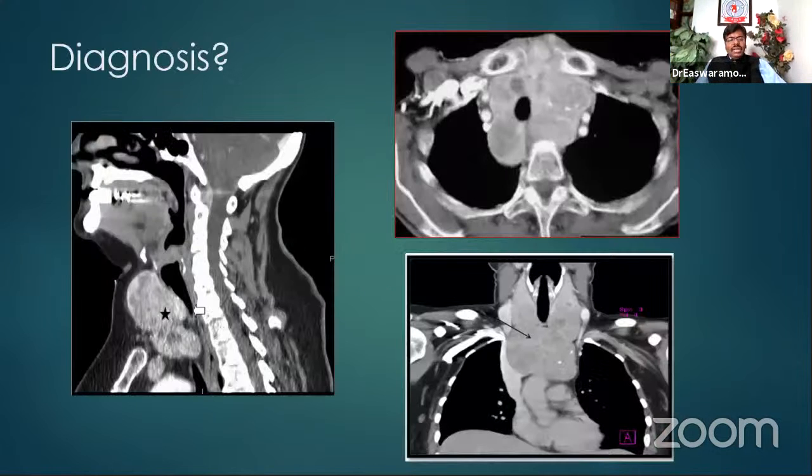And because of lack of time, quickly five questions. Let me go through. I want five volunteers who want to give. This is the patient who came with swelling in the neck with difficulty in swallowing and change in the voice, and we did an ultrasound, FNAC. Then the surgeon decided to do a CT scan, a cross-sectional image, and then a sagittal section and a coronal section. You should understand the various sections. Then only you will be able to interpret. Who wants to take a challenge?